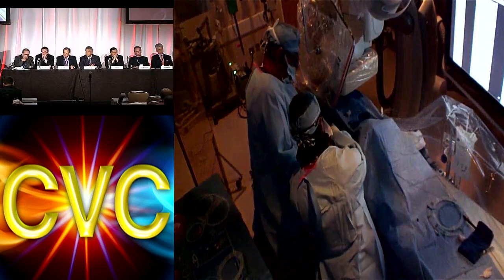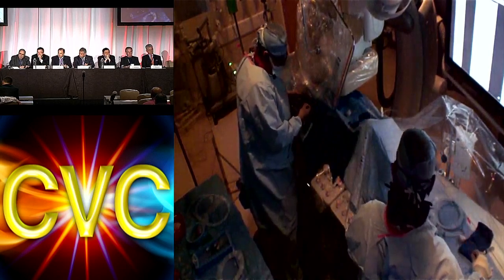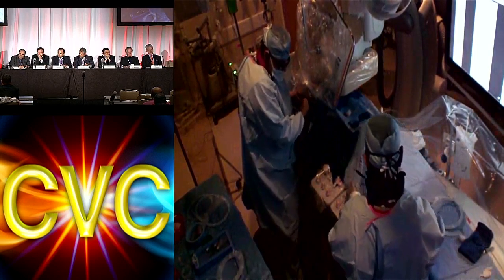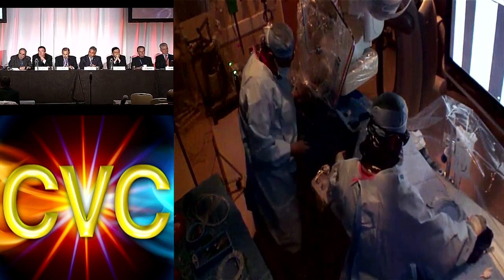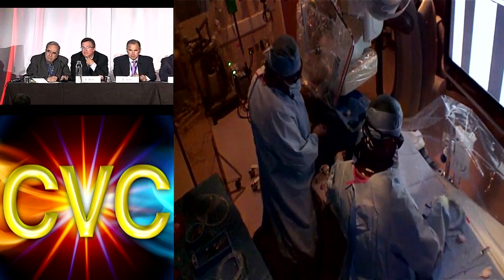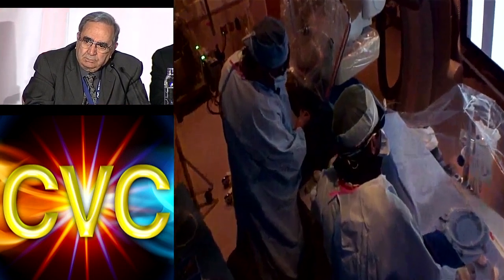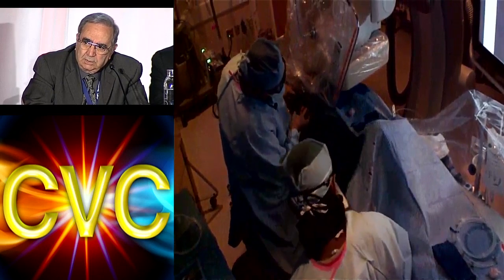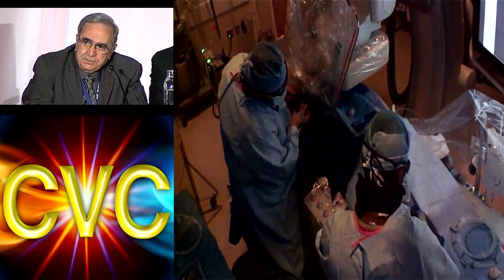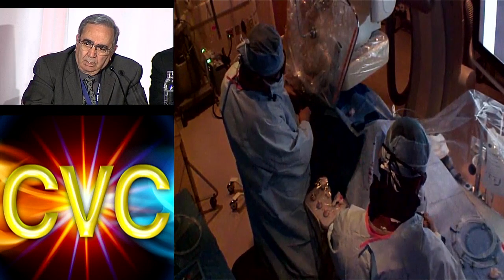Well, I personally would rather go from below. You can, of course, try your device. Any of them you have in your lab and you know how to use them. But I think at this point, probably a retrograde transpopliteal would be a better choice. At least if I was doing the case right now, I would go transpopliteal.